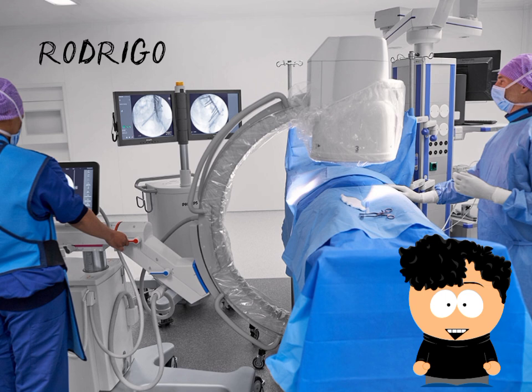Application of the equipment. Surgeries: C-arm X-ray equipment is commonly used in surgical procedures such as orthopedic surgeries and vascular surgery. Interventional procedures: used in interventional procedures such as stent placement and tumor embolization. Diagnostic: also used to obtain high-quality diagnostic images of various parts of the body.